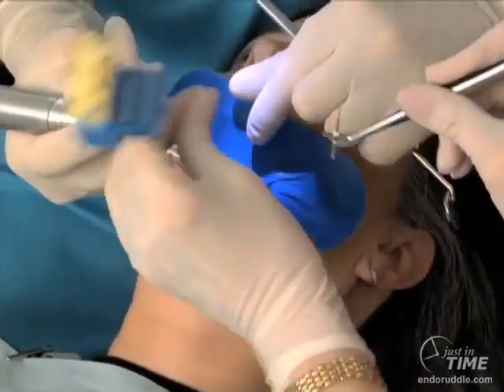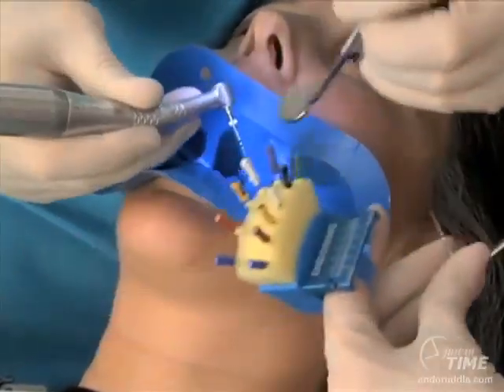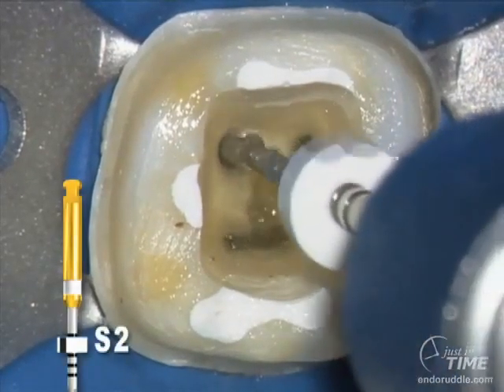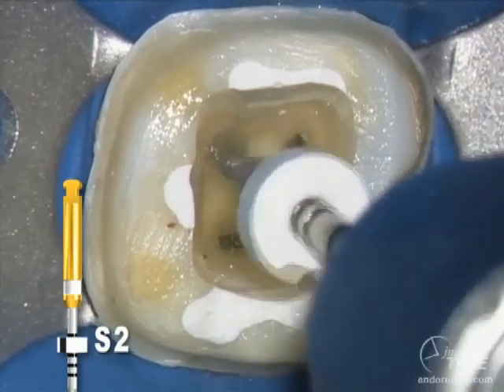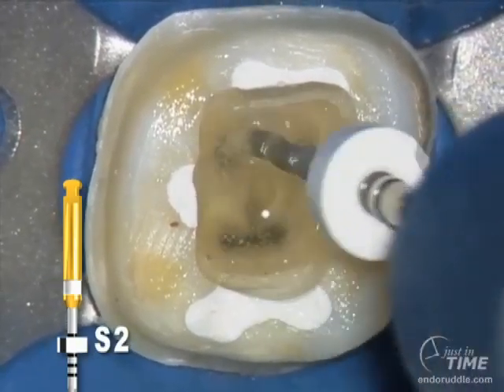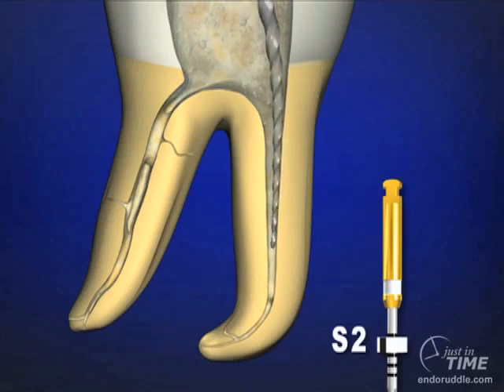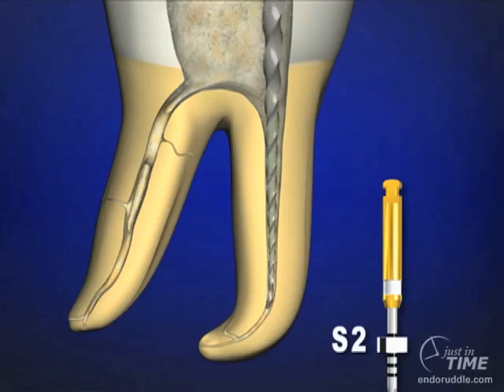It's interesting to work with assistants and train them so we can exchange instruments to benefit the economy of time. By taking in the white instrument, we can now begin to shape with S2. Brush, brush, brush. It's deliberate, it's intentional. You might even ask the patient to hold their head strong. I'm trying to convey to you that the brushing is quite firm. And again, by making lateral space, the instrument's completely disengaged during almost its entire shaping exercise.